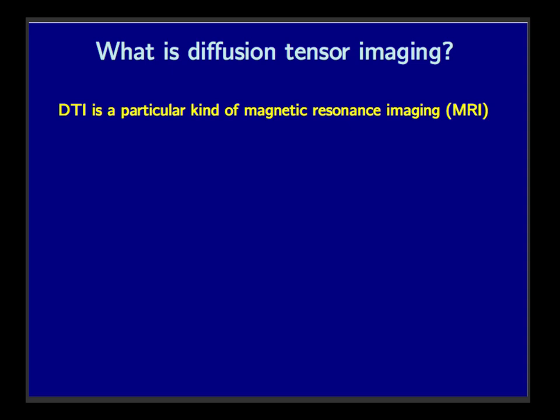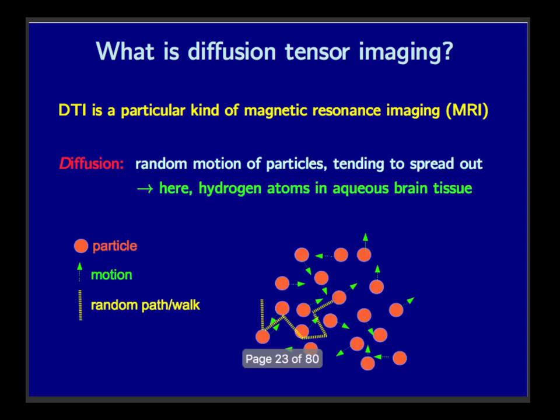Okay, so a lot of this deals with DTI. So what is DTI? Diffusion tensor imaging. It's a subset of MRI. And the diffusion part of it means that we're basing our measurement on looking at the random motion of particles. And basically, anytime you have a fluid, the molecules are sitting in there very small so we don't see it, but they're all jumbling around all the time. And if you, let's say, grabbed 5 of them and painted them one color and then let them go, they're not just going to stay there because they're all bouncing around randomly. So some will go one direction. They could all go in one direction, but statistically, they're equally likely to go anywhere, so they may spread out or something like that.